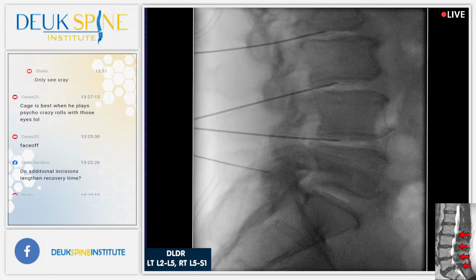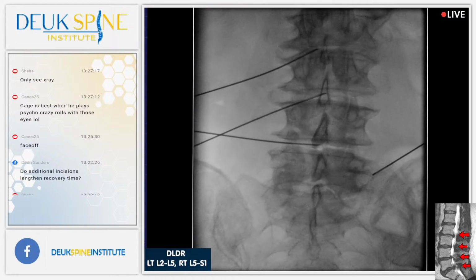Let's get an AP. Any questions from our audience so far? Yes. The question from Darren on Facebook. They asked, do additional incisions lengthen recovery time? Great question, Darren. Additional incisions do not lengthen recovery time. Not at all.